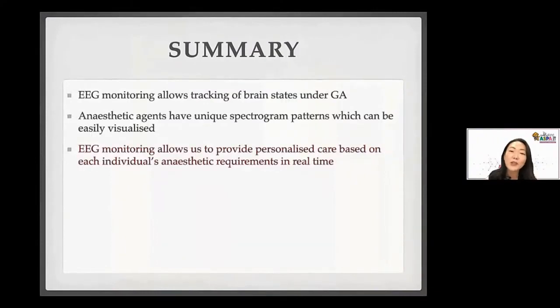EEG monitoring allows tracking of brain states under anesthesia. And you know that anesthetic agents have unique spectrogram patterns, which can be easily visualized. Our EEG monitoring will allow us to provide personalized care depending on each patient's individual requirements in real time, so like minute to minute.